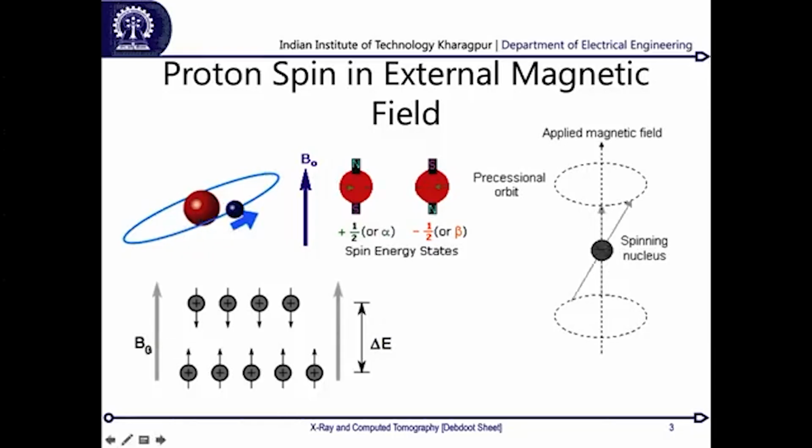But if I am putting down an effective magnetic field over there, everything needs to realign itself, and for that reason some of them which were at some haphazard orientation will align themselves with this orientation over here. Now, going from a haphazard orientation to this orientation, it loses some energy, which is passed on to some other ones which will align themselves opposite to this by taking on a higher energy state, and there is a total difference which is called delta E.